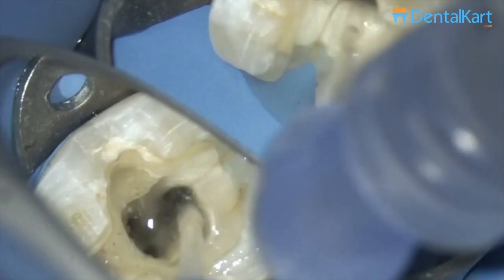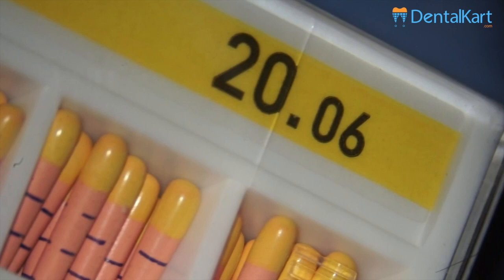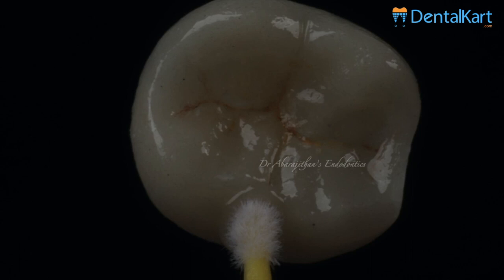In the end we again irrigate and agitate — this is done patiently for each canal plenty of times. Finally once the canal is clean for obturation, we use the same 20/06 GP corresponding to the last file used — this is the master cone. This is the final postoperative radiograph. You can see some sealer extrusion which was not intentional and is not advocated, but it is bound to happen with bioceramic obturation technique, especially in cases with lesions where there is a well-established patency.